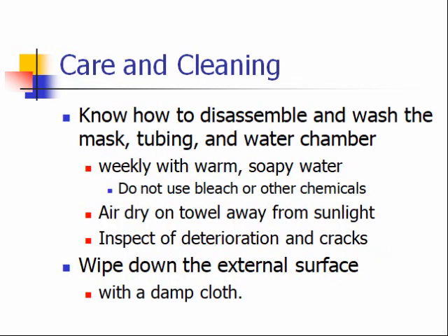I mentioned earlier about cleaning the device. When you get your CPAP device from the equipment company, make sure they show you how to disassemble it so that you can wash the mask, the tubing, the humidifier, or water chamber. That should be done weekly with warm, soapy water. Don't use bleach or other chemicals. Place the equipment on a towel to air dry, but have it away from the sunlight. Sunlight will break down some of the plastics.